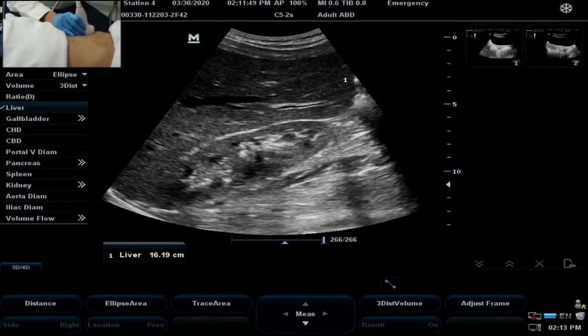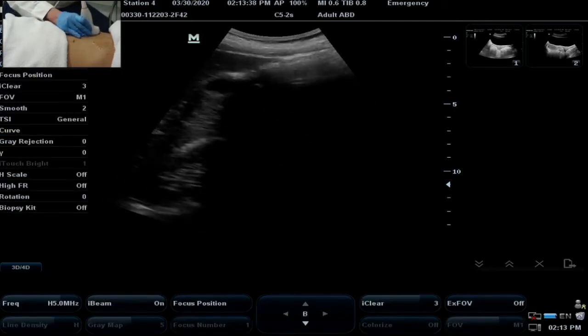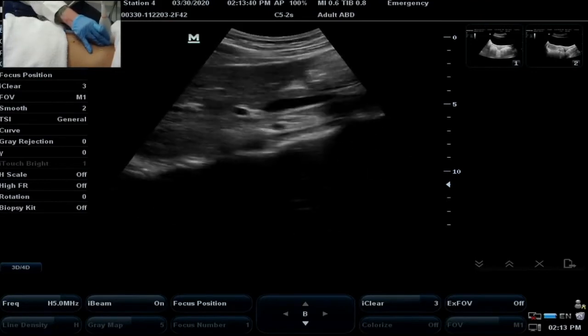And you have to be careful that you're trying to separate this out from hepatomegaly. So one of the first things I look at is my subcutaneous layer. And here I see this is a very thin patient, and so this really represents probably a very long and thin liver.